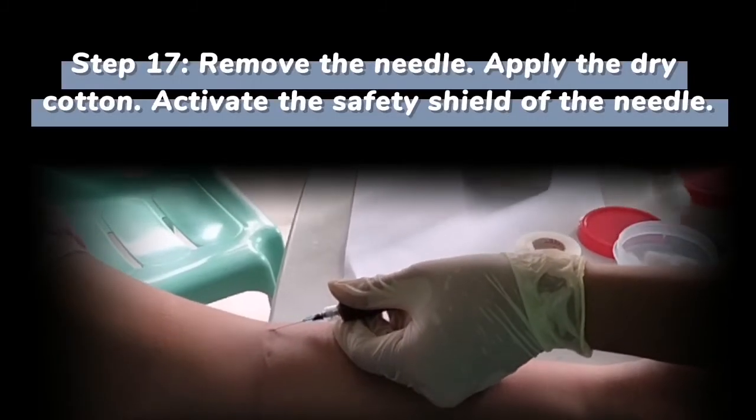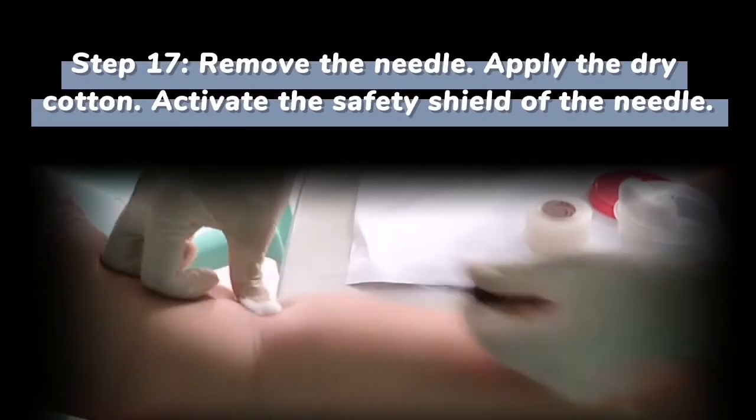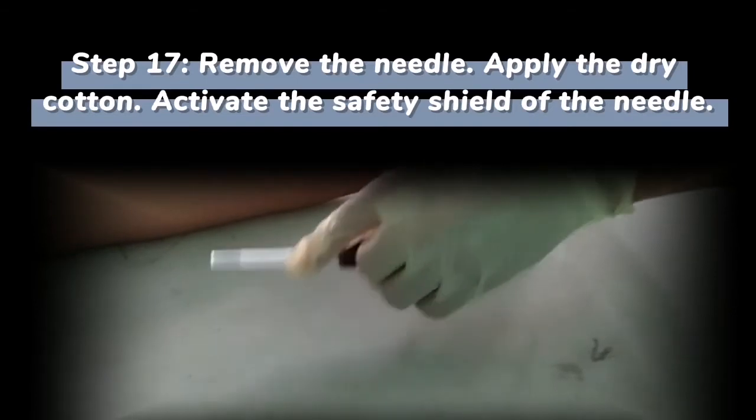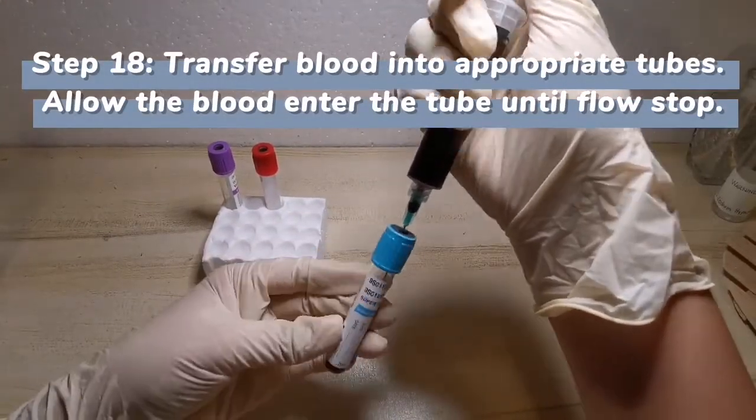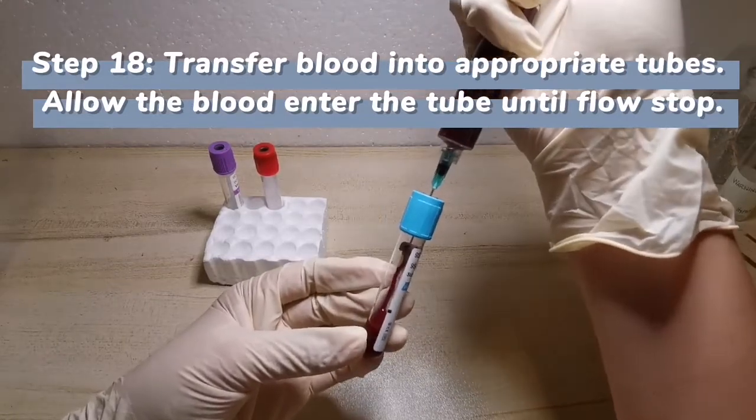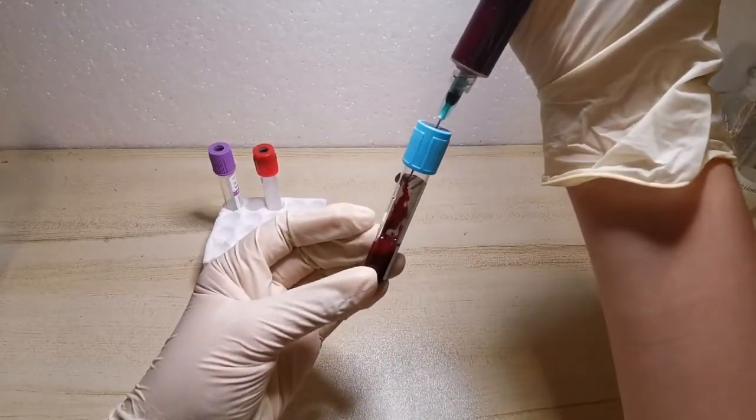After removing the needle, put dry cotton and apply pressure. Then recap the needle. Transfer blood into appropriate tubes and allow the blood to enter the tube until flow stops.